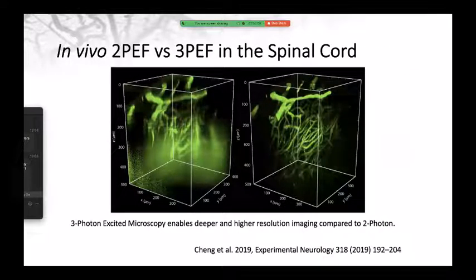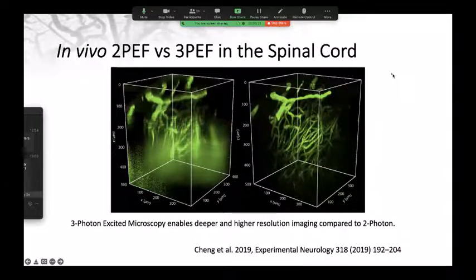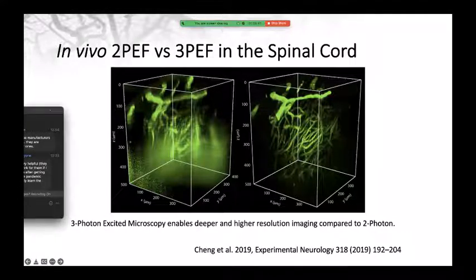All right, so once the spinal cord window is on, we have to use lasers in order to excite fluorophores in the spinal cord in order to see the structures. Since it's a 3-photon microscopy, there are also endogenous labels like THG and SHG that enable us to see different structures. THG mainly helps us to see what the myelin looks like.